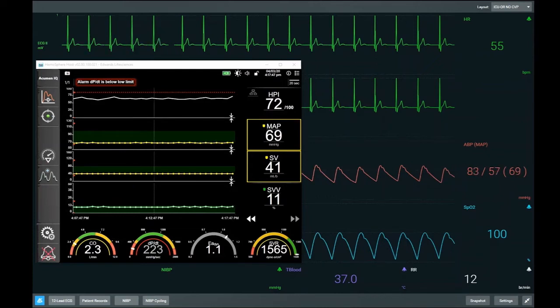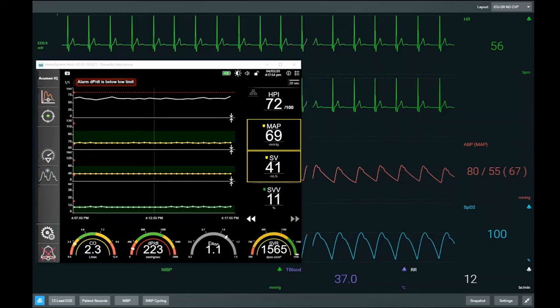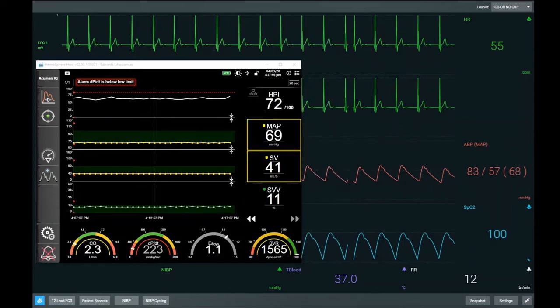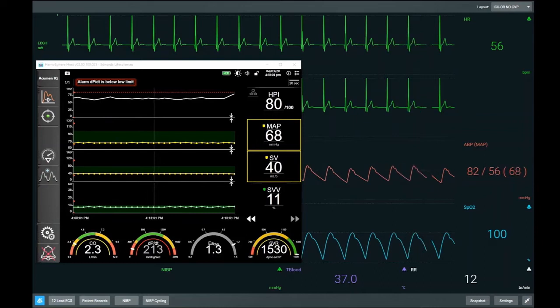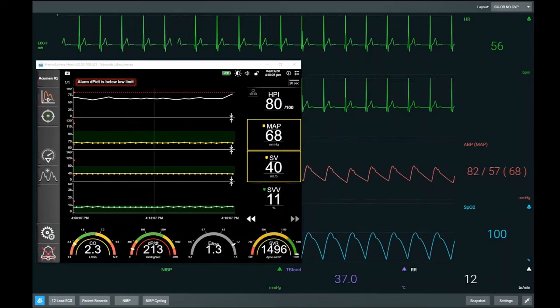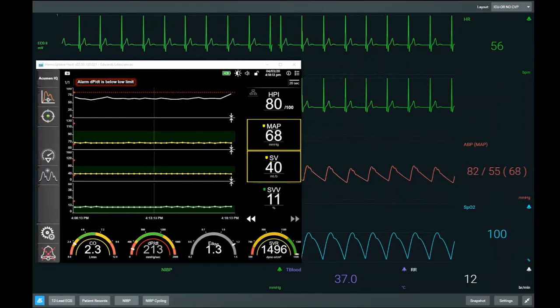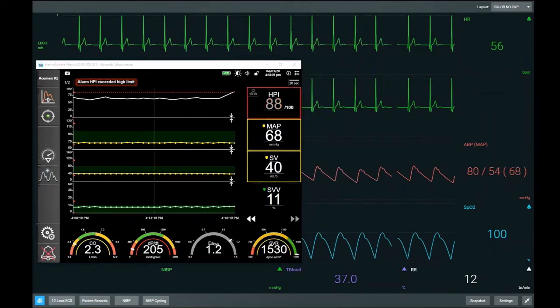For reference, at the start of the procedure when the arterial line was inserted awake, the true DPDT baseline was 250. As the simulation progresses, our HPI is starting to increase — gone from a baseline in the sixties up into the eighties. Our mean arterial pressure hasn't changed, but this Delta HPI changing from 60 to 80 suggests there is more cardiovascular instability being added into the system.